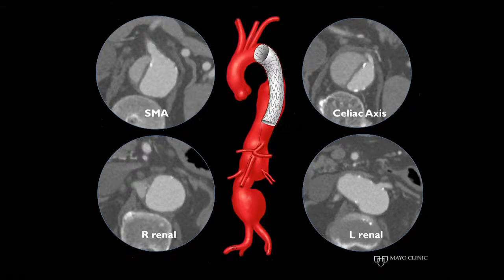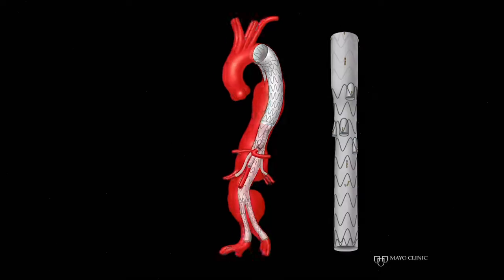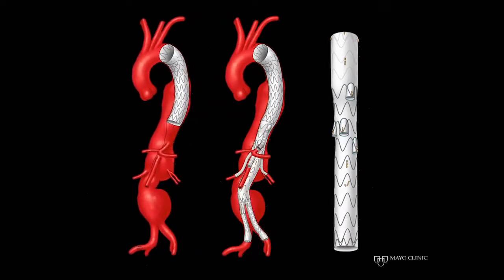It is a little subtle to see, but there is a small reentrance site at the level of the superior mesenteric artery. We planned a definitive distal thoracoabdominal repair using a 4-vessel, patient-specific branched endograft.